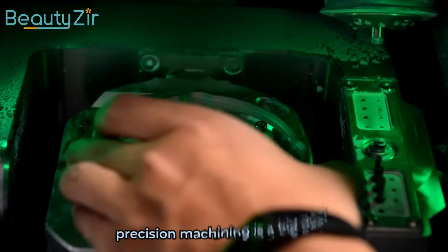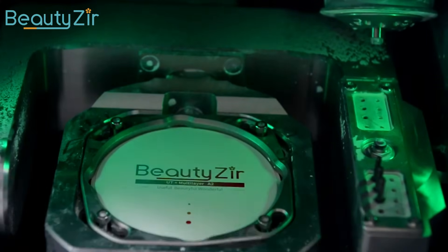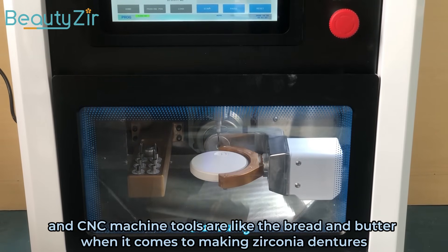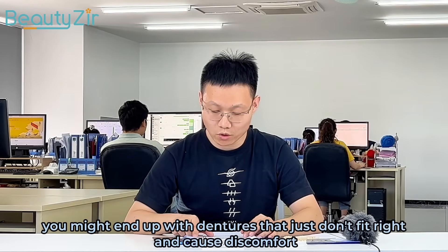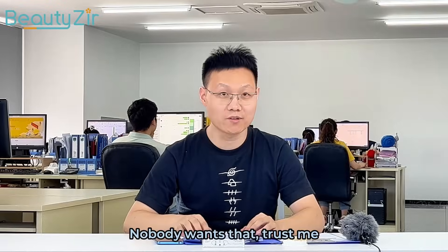Next up, precision machining is a big deal. Digital design modes, CAD/CAM technology, and CNC machine tools are like the bread and butter when it comes to making zirconia dentures. If you don't pay attention to precision machining, you might end up with dentures that just don't fit right and cause discomfort.